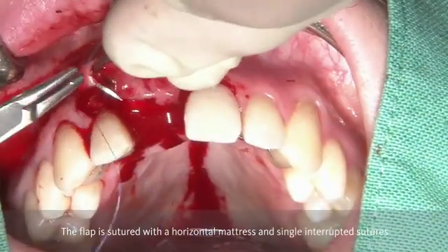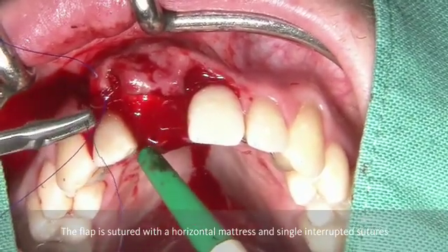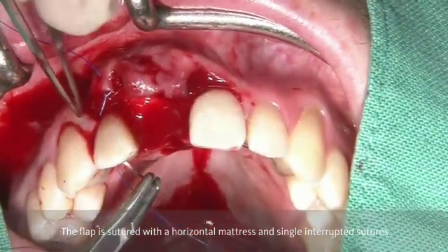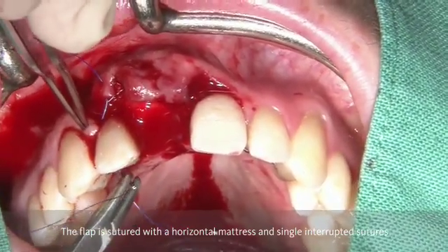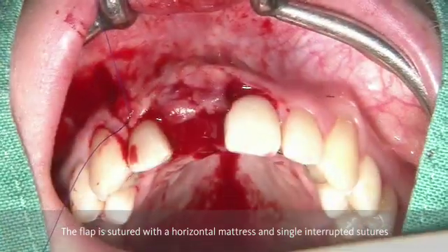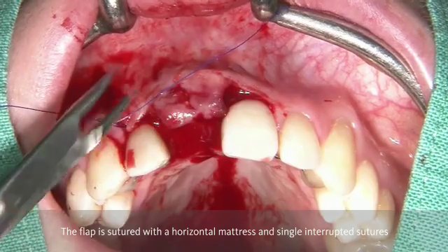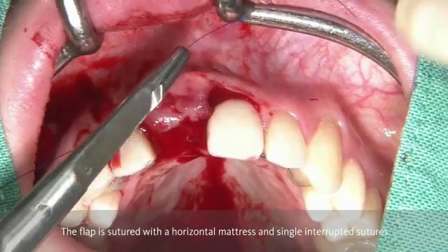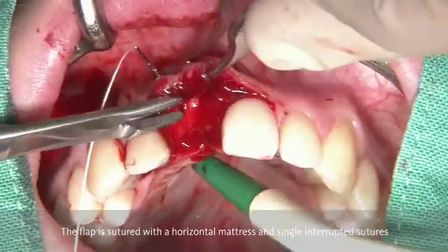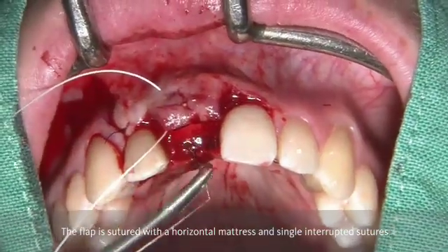In order to be able to close the flap, because we now have extra volume, it is necessary to do a periosteal releasing incision as has been done here. Then it follows by having the first suture at the corner of the vertical releasing incision with a 5-0 or 6-0 suture in order to adapt the flap in this area. Like this, we reposition the flap at the correct position. The subsequent suture is, for me, the most important one — it is the horizontal mattress. The horizontal mattress is going to be performed with an ePTFE suture material.